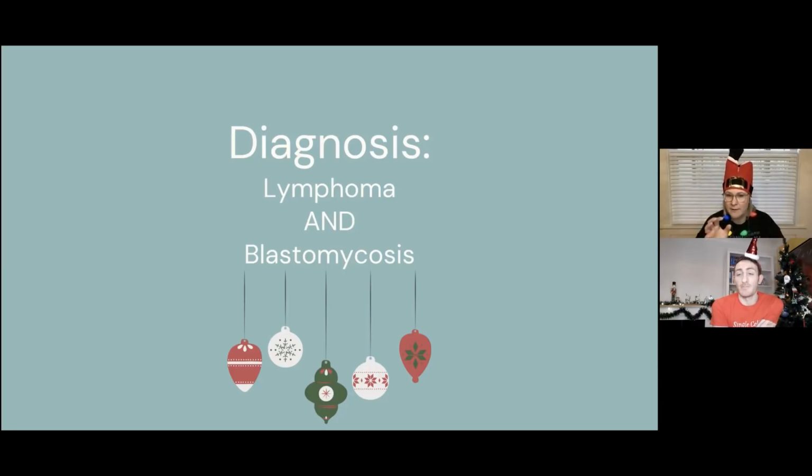I totally agree. One thing that's hard is if you get multiple lymph node aspirates submitted as one and they're not labeled. I get a couple of slides that are very straightforward lymphoma, and then a couple more that look more reactive. My question to myself is, did those two come from the same lymph node? Maybe this isn't lymphoma, and they hit a reactive lymphoid follicle. It's not common, but I just got a bunch of cells that looked like lymphoma on this slide, and on this slide it's clearly more reactive.